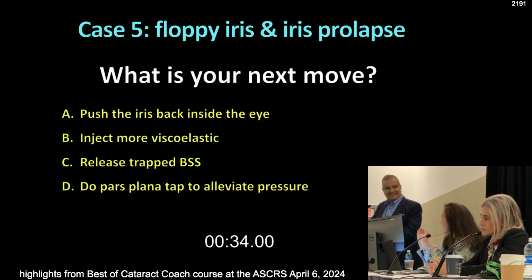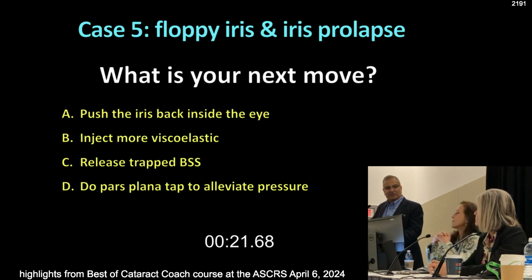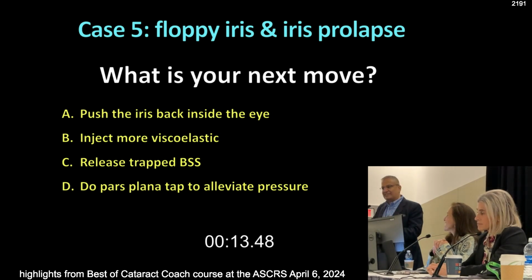Like you taught us, Uday, the iris always follows the pressure gradient. Right, so in this case I put way too much BSS to do the hydrodissection. As a result, I highly pressurized behind the iris, and obviously in front of the iris the pressure is very low, and so the iris prolapsed out of the eye. Probably the first hint was you saw the nucleus come up, and then you saw viscoelastic being burped out of the incision. I probably should have stopped and said, wait a minute, let me not continue on this path. But there is an easy way, right?